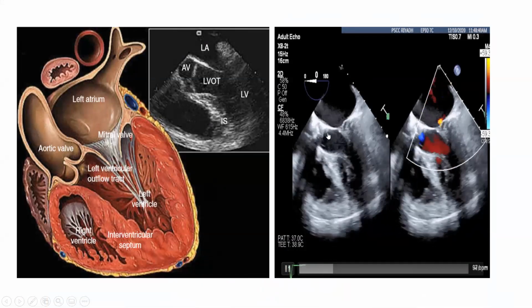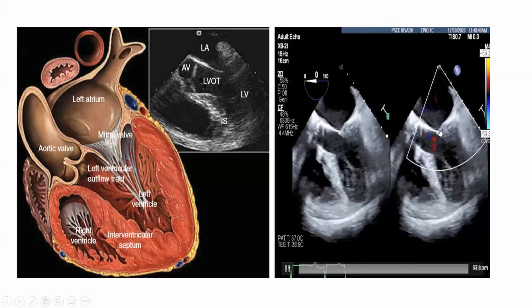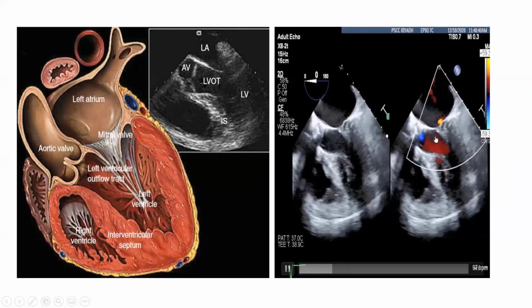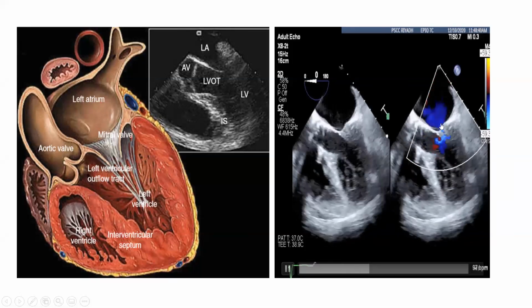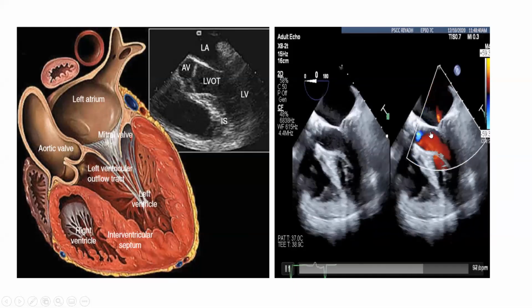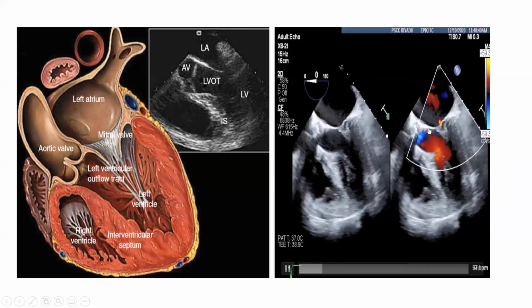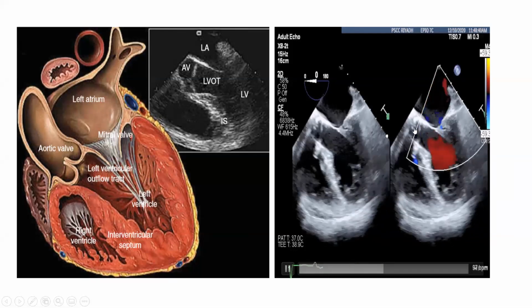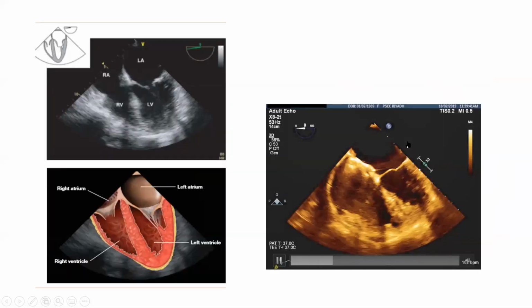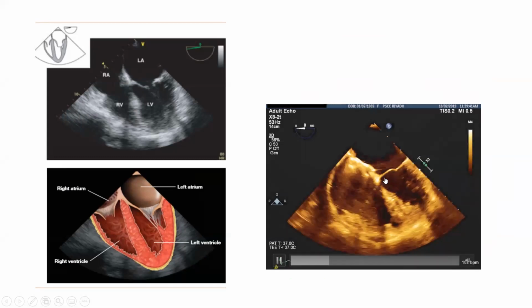5-chamber is important if there is AR. Okay, and at the same time, the mitral valve, I want to assess the cause of MR. This is the same patient for clip. The MR is not coming from this scallop of the mitral, A1, P1. So when I pull it up, I will get A1, P1 at 5-chamber. If I go down a little bit again, I will go to 4-chamber, and I will cut A2, P2.